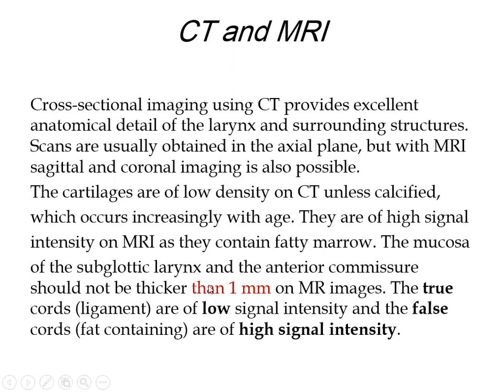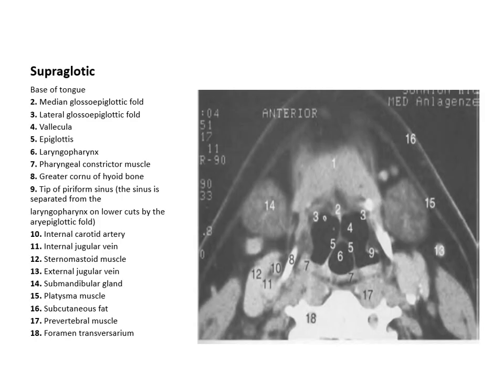On MRI, the true vocal cords are of low signal intensity while the false vocal cords are of high signal intensity. The true cords are muscle, giving soft tissue signal intensity, while the false cords contain fat, giving high signal intensity on T1.